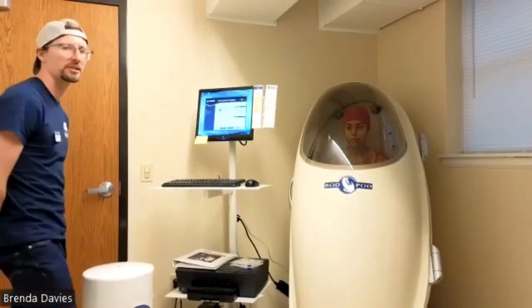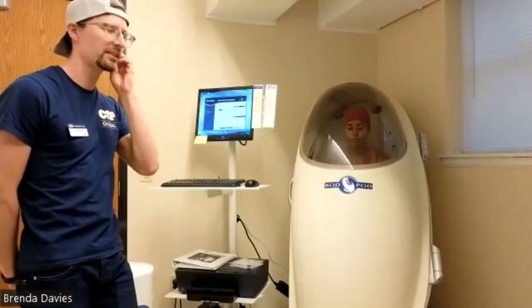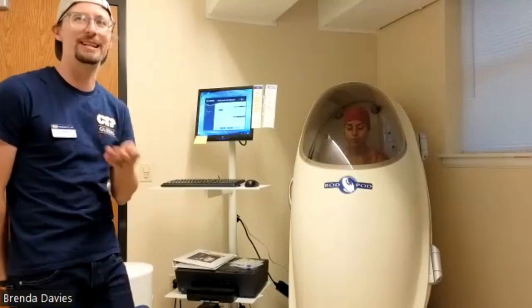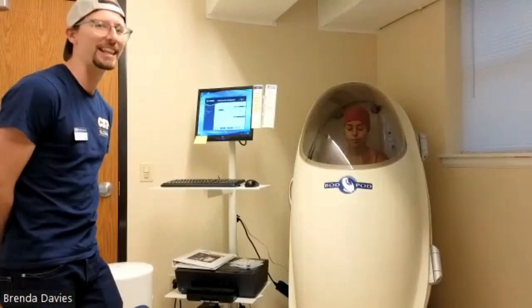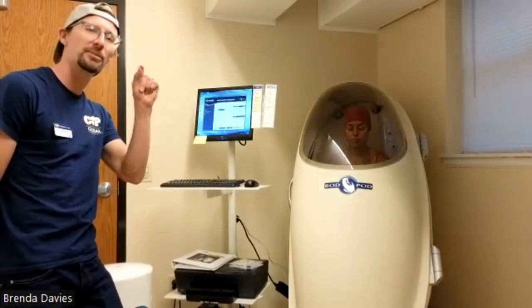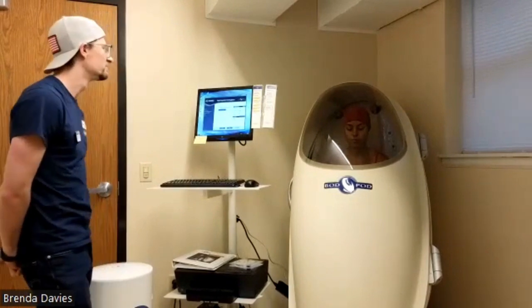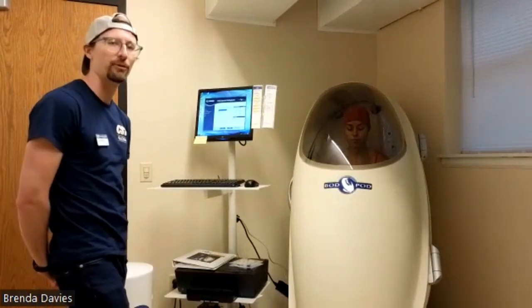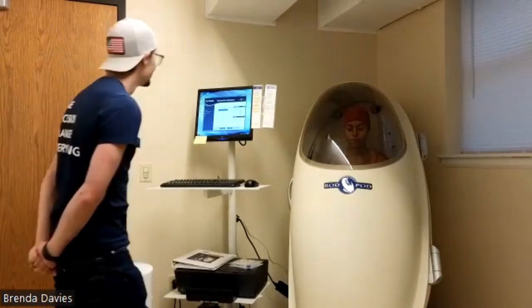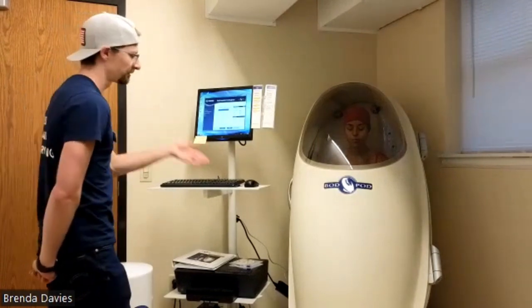So for those of you that were interested, the weight from the manual compared to the weight that the Bod Pod gave us was about 1 pound off. But we actually kind of knew that because Dr. Karen and I were looking at the manual scale and we realized we actually have to tweak it just a little bit because it's overestimating by just a smidge. So we didn't want to mess with that too much 10 minutes before this assessment, but it's working. And again, we have an accurate measure of body mass from this.